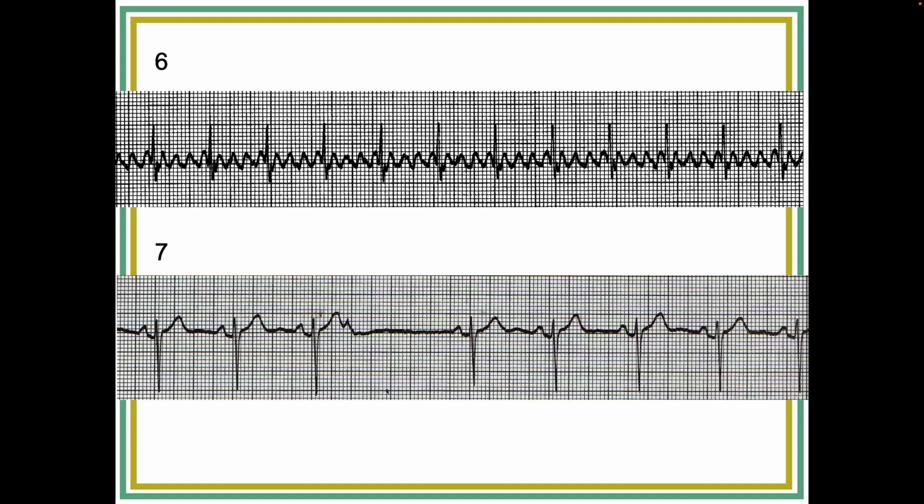If you drop the first 2 words and kept the second 2 words, you'd be accurate. So think about it for a minute. The first term tells you where it originates. It can't originate from the sinus node, okay? And so this is atrial flutter.